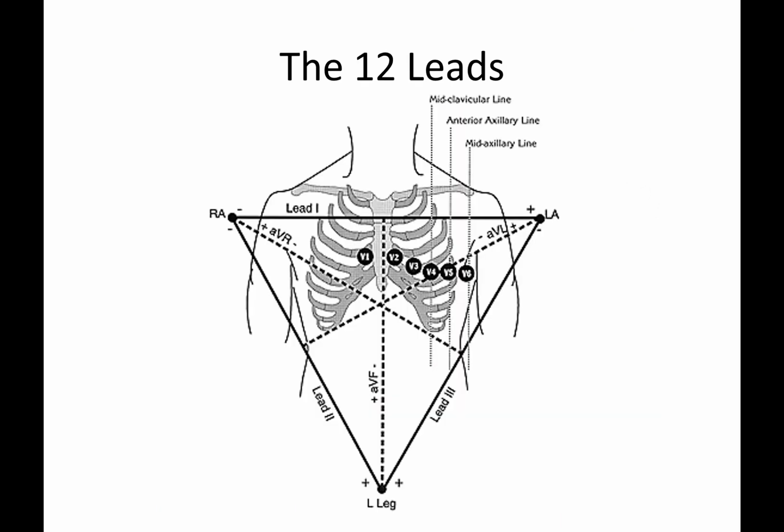First off, this is a more traditional layout. You may have seen this triangle shape before. Basically what it represents is you've got your right arm and left leg. They're assuming a 3-lead system. With that information, you can say negative here, positive here. That's good old-fashioned lead 2. Positive down here, negative up here. That's lead 3. And there's lead 1 with a negative and a positive.